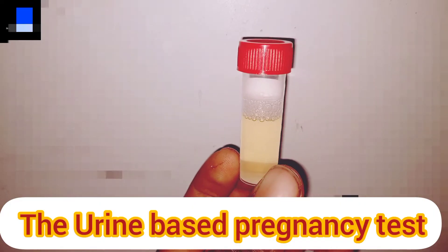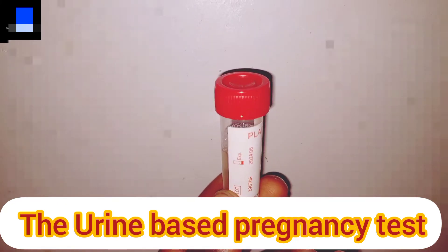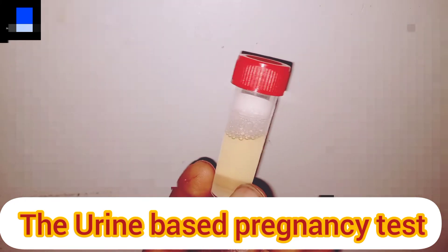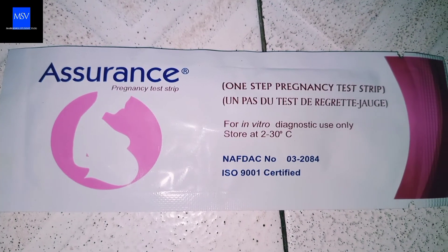Number one: urine test. For you to be able to use this method, you need to get your urine — or the urine of the patient you want to test — using a sample collection tube. Another thing you need to do is to get your Pregnancy Test Strip.